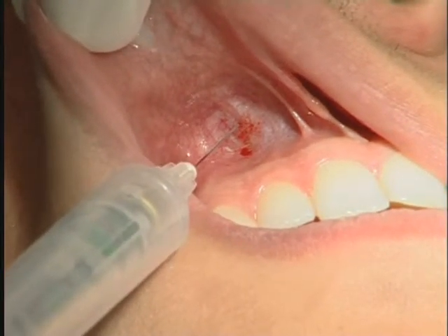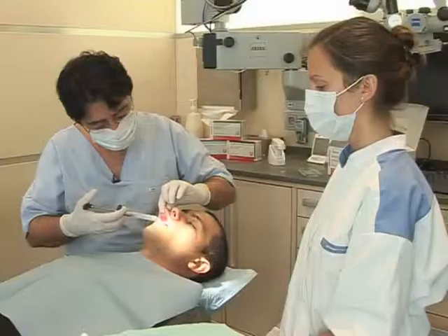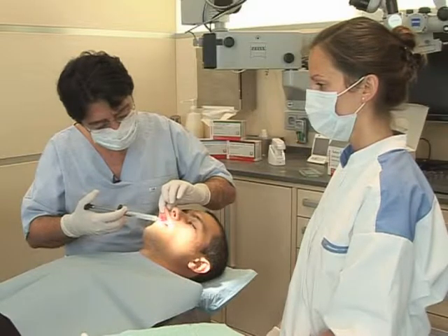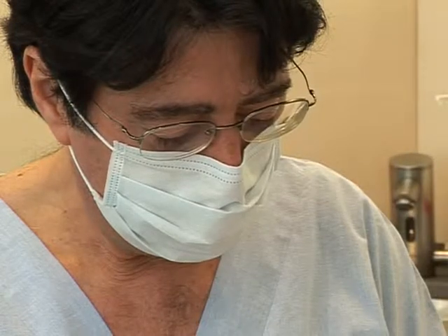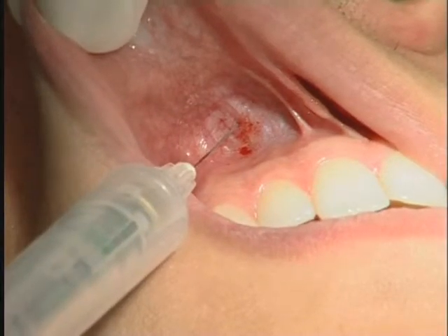After injection of a few drops of the solution, the needle is pushed towards the apex. On contact with the bone, the needle must be withdrawn slightly to avoid subperiosteal injections, which are painful and will cause post-operation pain.